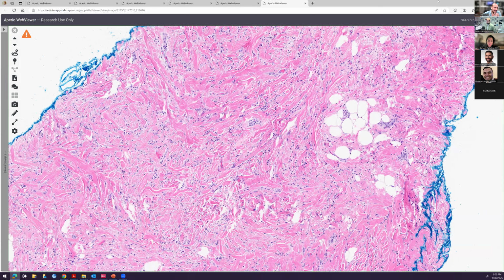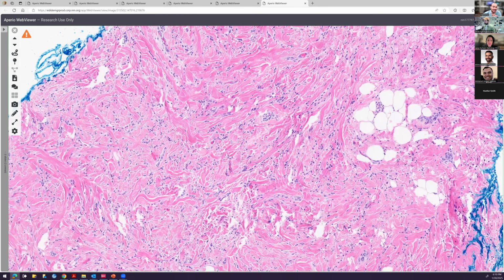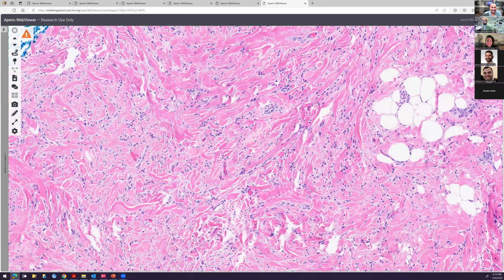Yeah, see this ropey collagen. Really long band. Okay, there's ropey collagen, right? Yeah, ropey, eosinophilic, that's true. Okay. I see some fat. I don't know if the fat is part of the lesion or not part of the lesion, honestly. Could be part of the lesion. The answer is, I don't think anybody knows really. Okay, that's allowed. All right, so then let's talk about the cells.